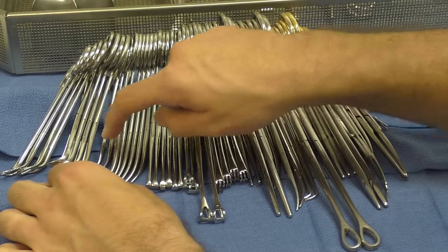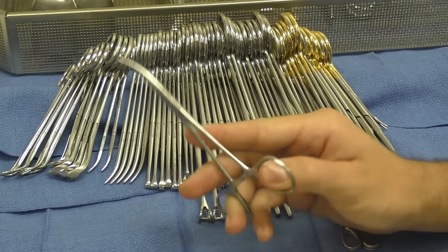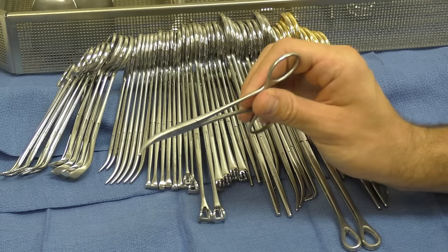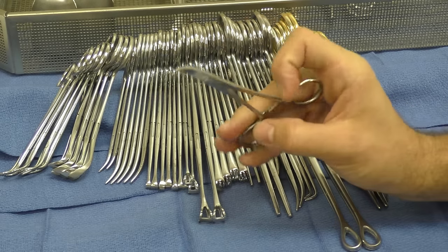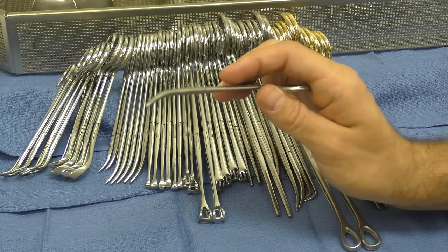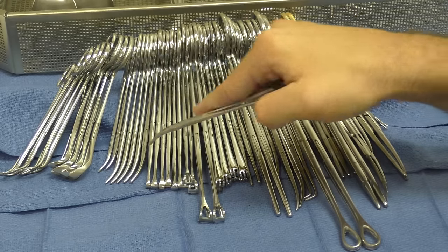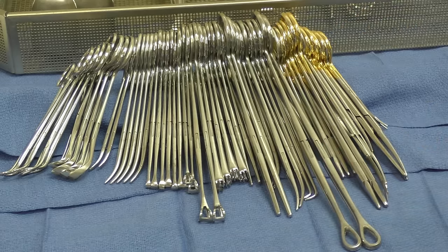So the slightly bigger brother to the mosquito is the Kelly clamp. The Kelly clamp is not much bigger, maybe like half an inch bigger than the mosquito. This is kind of like your general purpose clamp. I see this clamp used in the OR more than anything else. If the surgeon asks for a clamp, they're usually wanting this clamp right here. Your general purpose clamp. Again, used for similar things like the mosquito, blunt dissection, stuff like that.